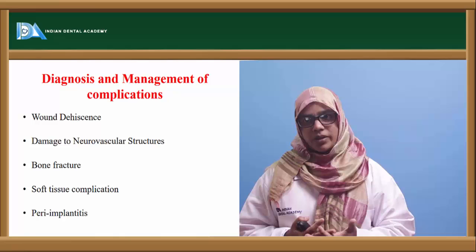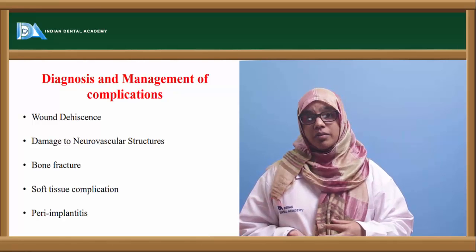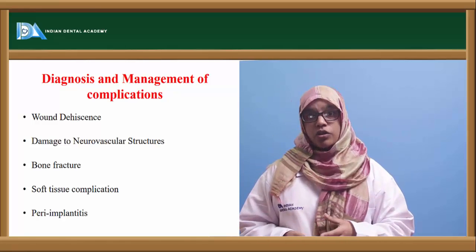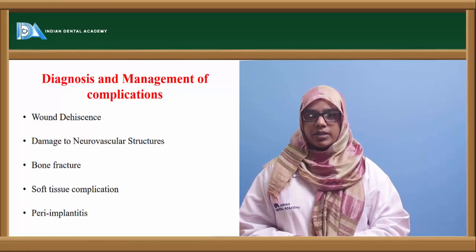Then soft tissue complications can occur. Your drill might slip and cause lacerations of the soft tissue. Sometimes the patient has come to you because of trauma, so there is soft tissue loss and tooth loss as well as bone loss. You might have to augment the bone, then at a later stage augment the soft tissue, and then plan for the implant placement.